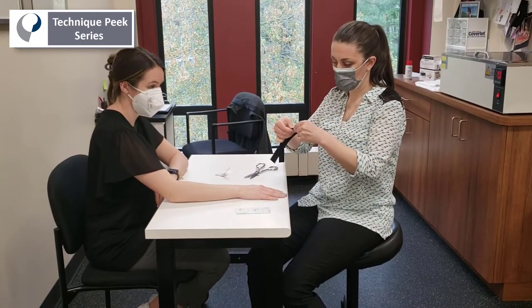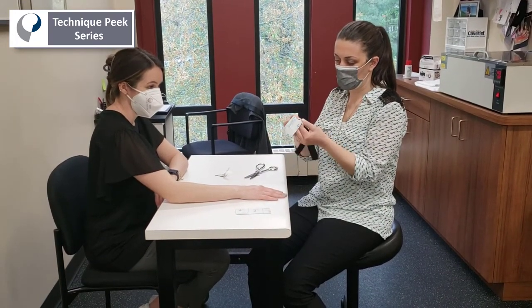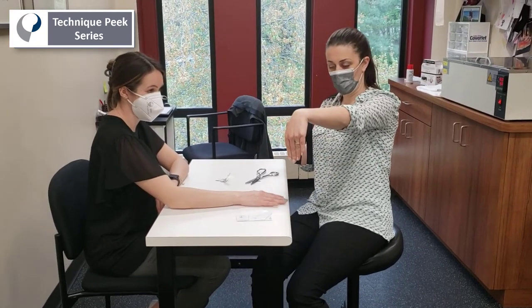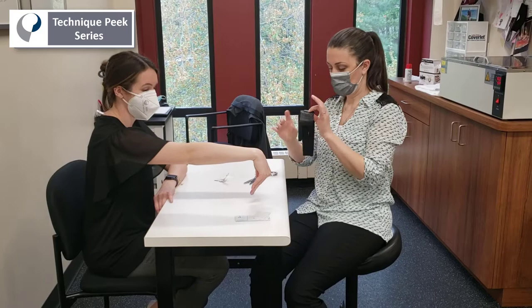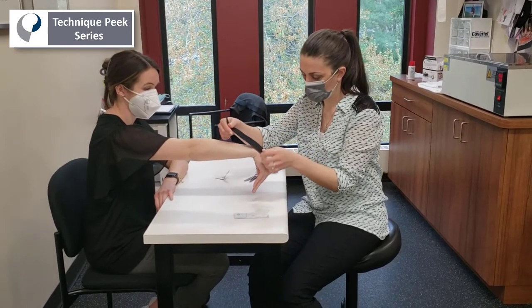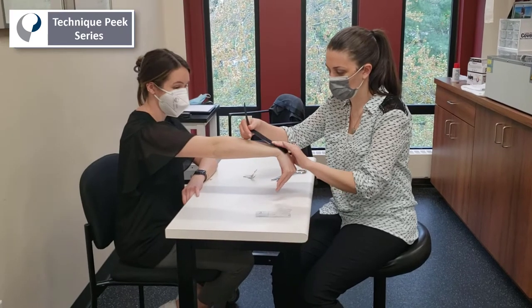We're going to tear the tape just before it separates into the two tails. Then we're going to have the patient go into wrist flexion and elbow extension and apply this anchor just distal to the wrist crease with no tension.